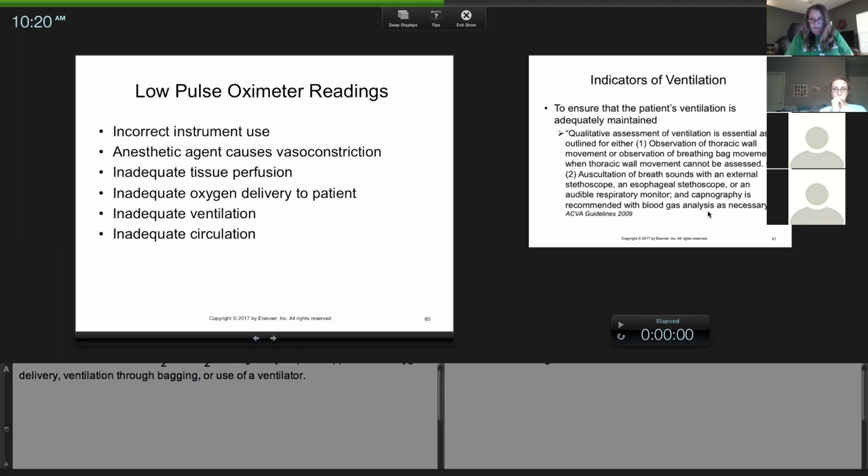And all of a sudden, the dog gets pink. I hook him back up. He's breathing 100% normal. And so I started talking to the student, and I said, okay, well, what was happening when you were in here? Well, she was listening. You have to listen and bag the patient to see if there's a leak. And she heard air, so she kept filling up the endotracheal tube cuff. With a 12 mil syringe, she did about 12 of those syringes. I said, how many times did you do this? And she was like, I kept filling the cuff, filling the cuff.